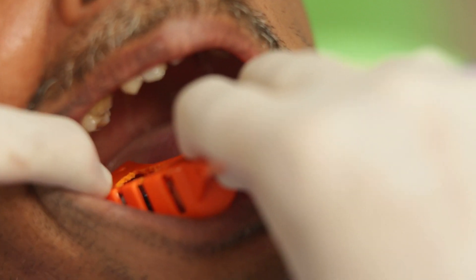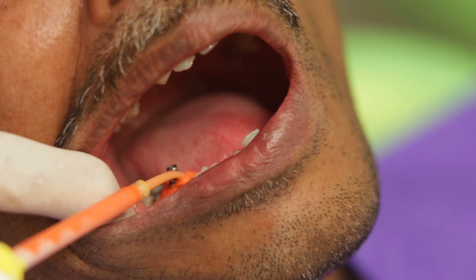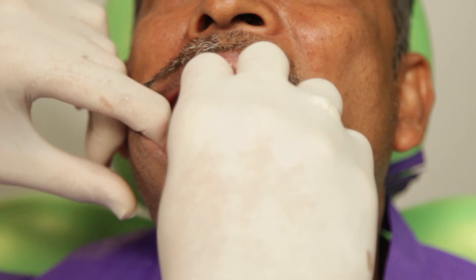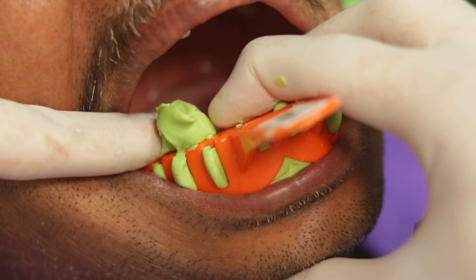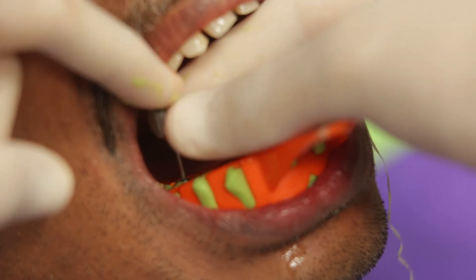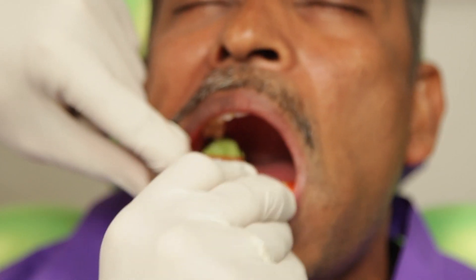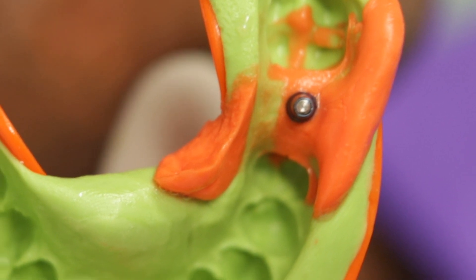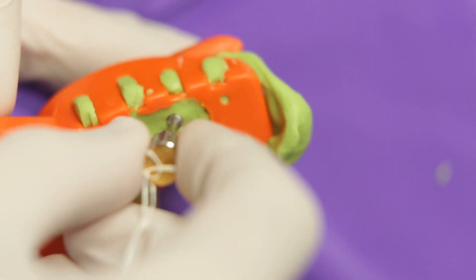That's the reason it's called an open tray impression. I will then syringe some light body around the impression post while my assistant loads the tray with putty. I will now seat the tray in. You see all that material coming out? I will just wipe it away to expose the screw. Once the material is set, I will use a hex driver to loosen the screw and remove the impression. You can see that the abutment has been picked up along with the impression. All I need to do now is attach the lab analogue to the impression post and send this to the lab where the impression will be poured and processed further.